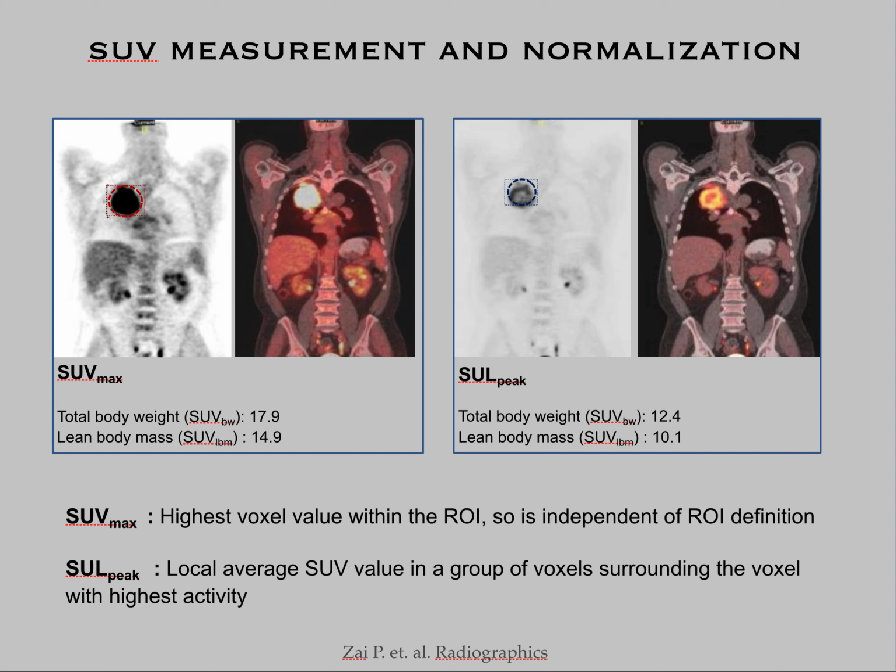You can see that there is significant variability in terms of which variable we measure and how we correct it. So if the threshold for response is 30%, just doing a different measurement can easily exceed that. So again, it's very important to be consistent.